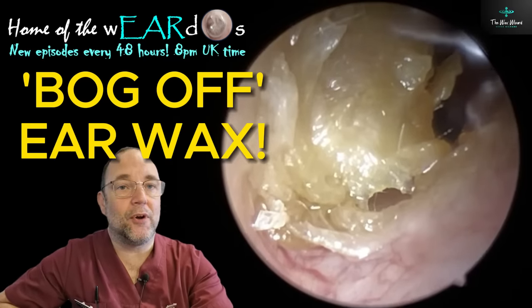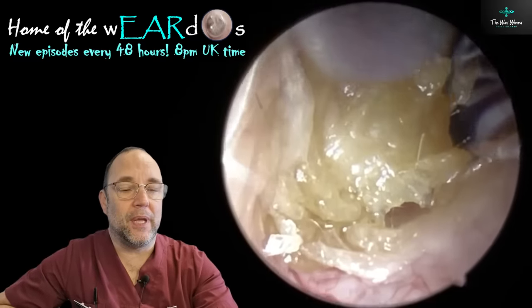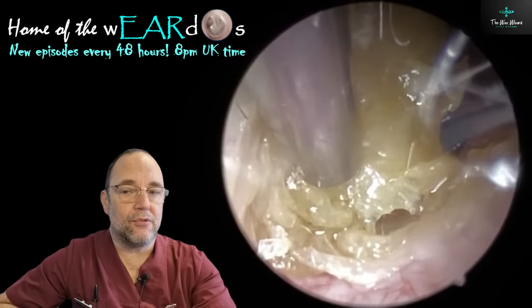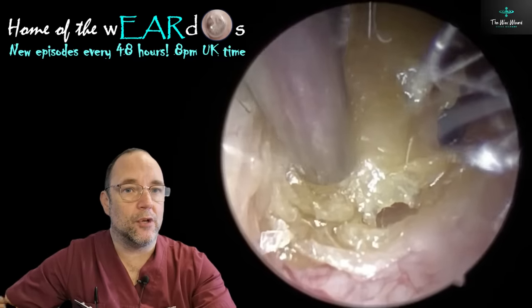Hello, good evening, good afternoon, good morning or good night, and welcome. It's Nurse Richard, the Wax Wizard. Thanks for joining me. Really nice looking procedures today. There's three ears in this, two patients - husband and wife.